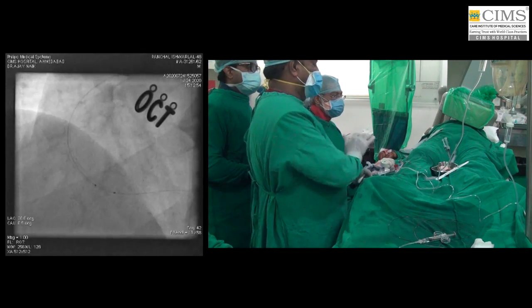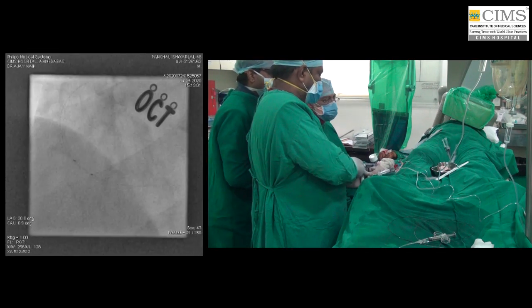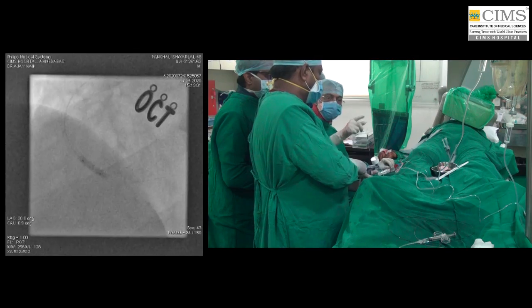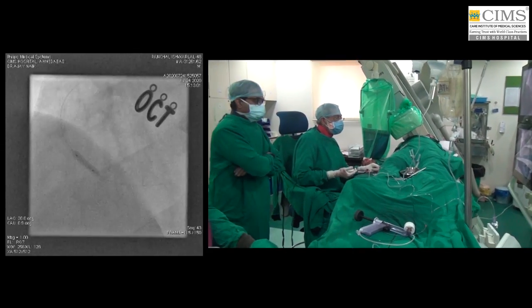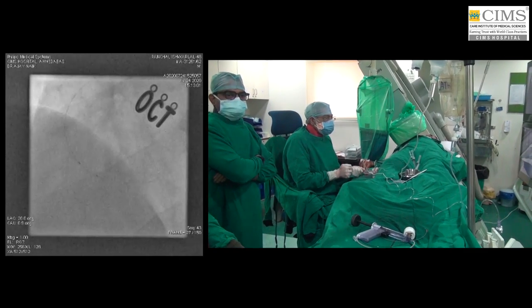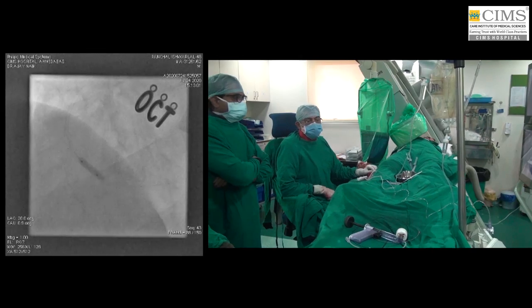So let's go ahead and place the balloon properly, and Dr. Vineet will start inflating. So we have post dilated with the 3.5 balloon, starting from the mid distal part to mid, and then the proximal part of the stent.